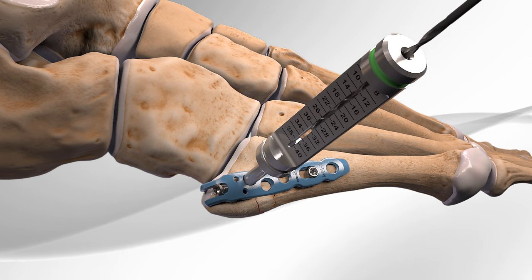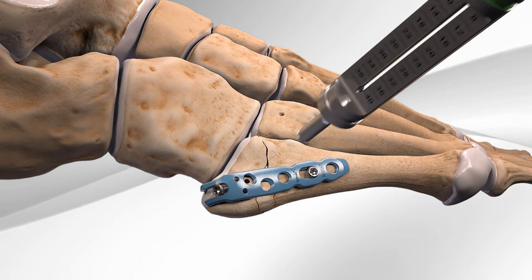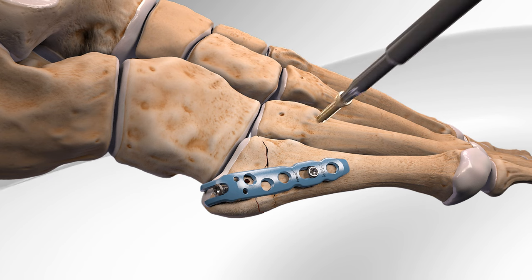Lastly, an attachable measuring guide is used on the remaining holes and the final screws are inserted to complete the surgery.